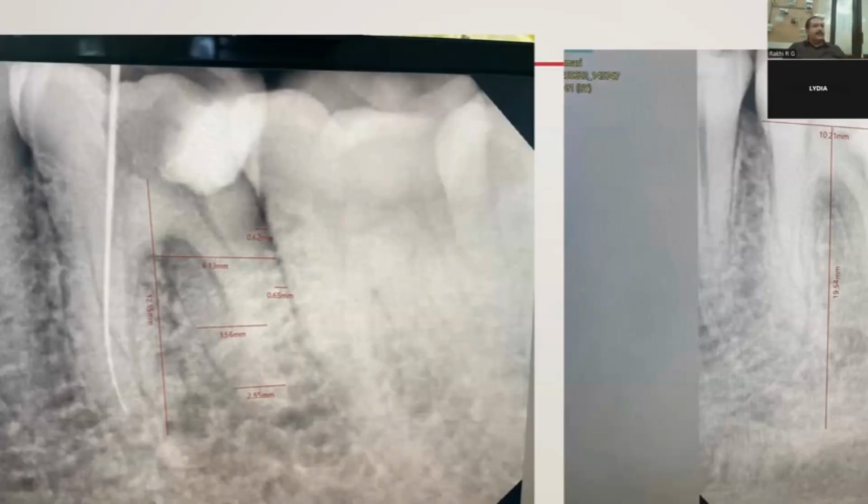There you can do some kind of adjustment. So spare more space between the implant and the tooth which you are not going to connect. In other words, spare more space between 7 and 6 rather than the portions of 6 which you are going to connect together. You understand?